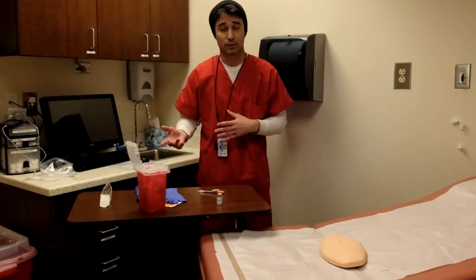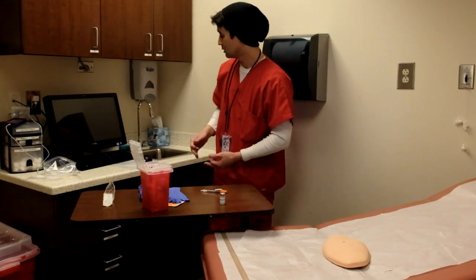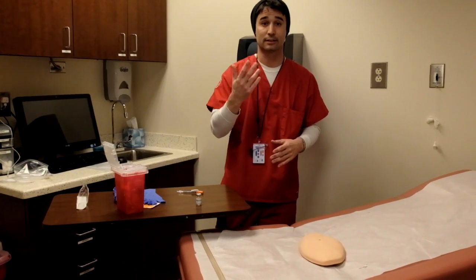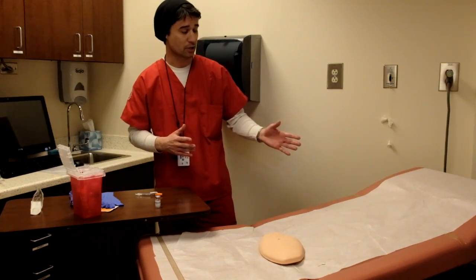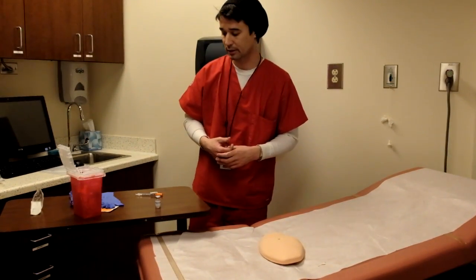Now, after we have drawn our medication into the syringe, we're going back into the patient's room. Go ahead and practice our hand hygiene. And also make sure we assess or check the seven rights of the medication. We'll also ask the patient if they have any hypersensitivities to the medication that's going to be given — we don't want any allergic reactions that could possibly happen.